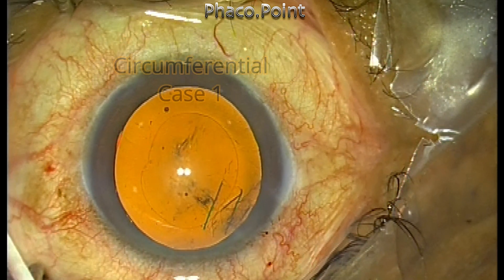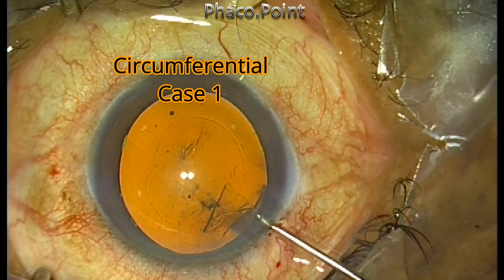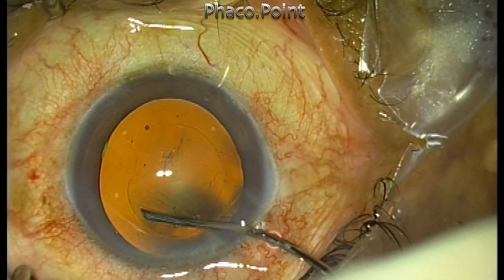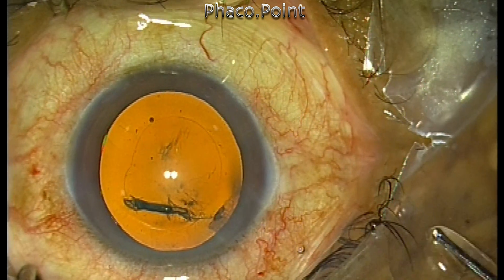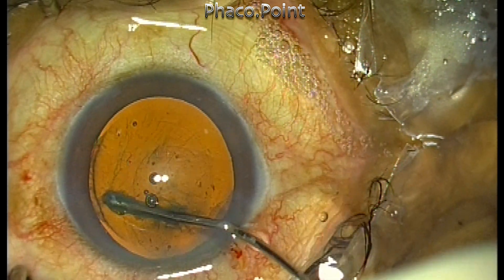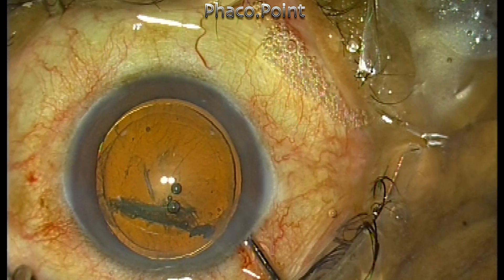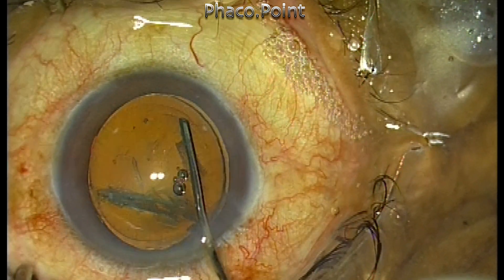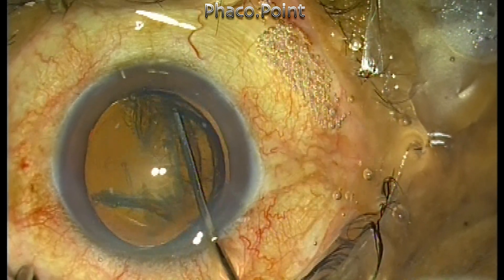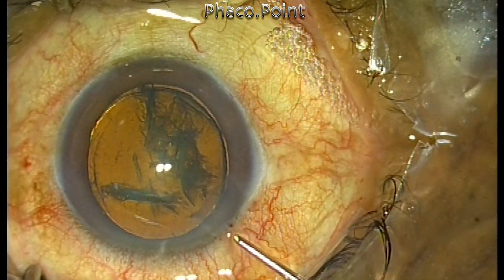In the first case, I'm going to demonstrate the circumferential technique of hydro delineation, checking if the cannula is patent before injecting the fluid. We push the cannula into the substance of the nucleus near the mid periphery, and then inject a short burst of fluid which will find its way across the lamellae and demarcate the circumferential edge of the endonucleus.